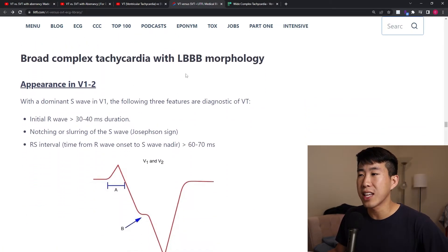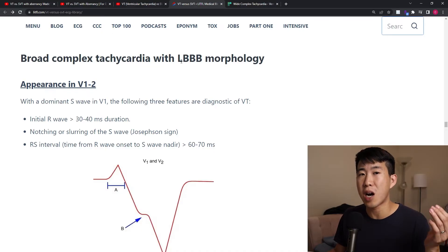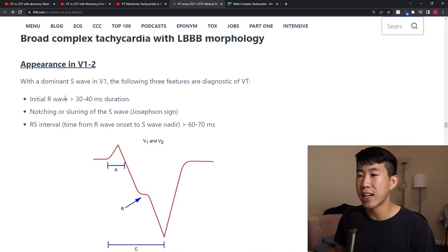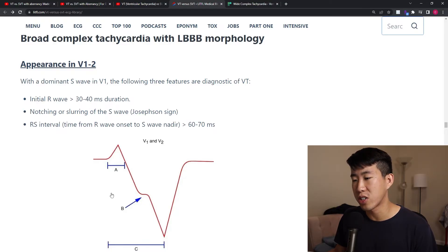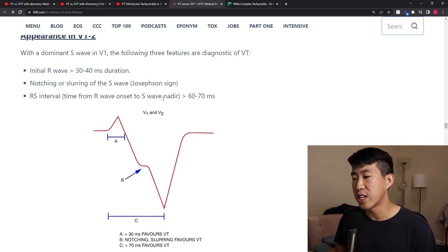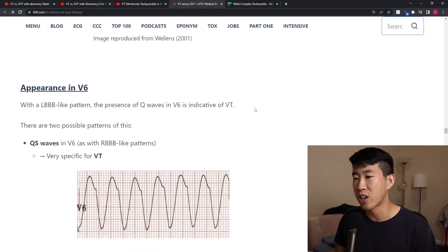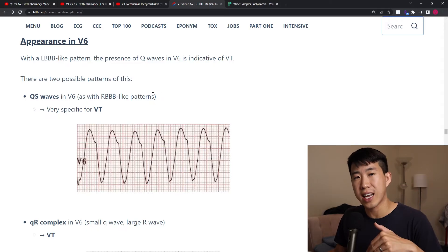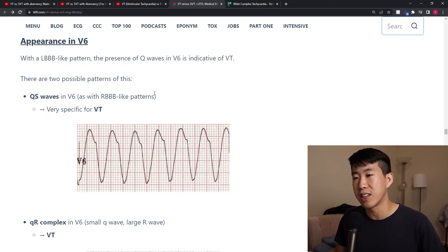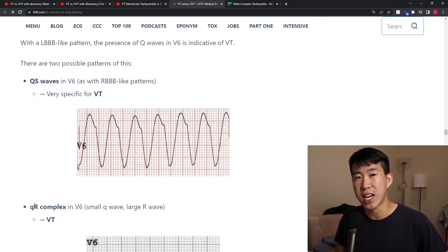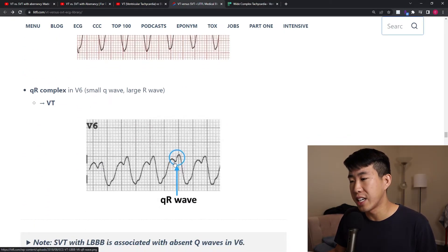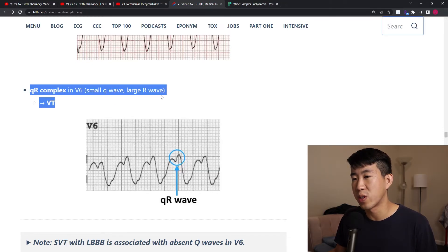For left bundle branch block-like morphology — dominant negative wave in V1 — you look at the R wave in leads V1 through V2. If the R wave is greater than 30 to 40 milliseconds in duration, you have Josephson sign (notch or slurring in the S wave), or the RS interval is greater than 60 to 70 milliseconds — these are all suggestive of VT. In V6, you look for QS waves (purely negative with no R wave) or a QR complex with a tiny Q wave before the R wave, which suggests VT.